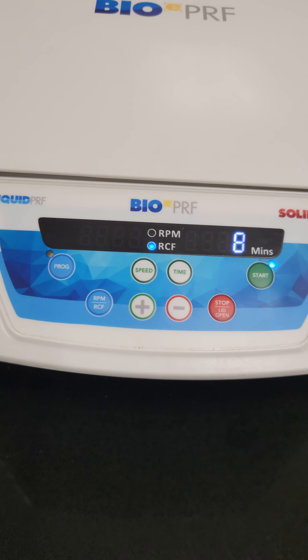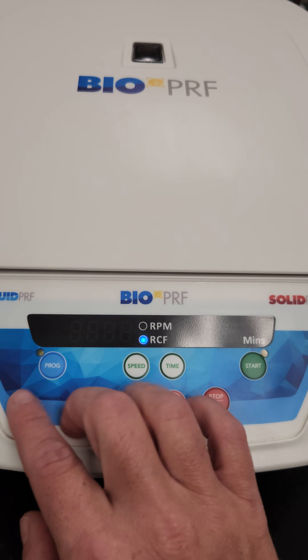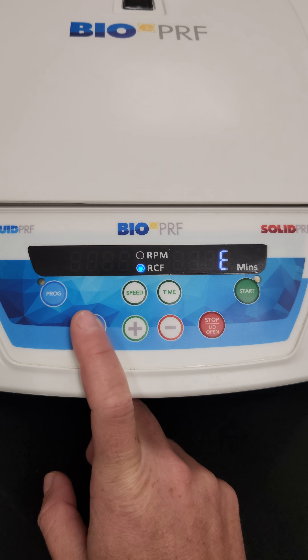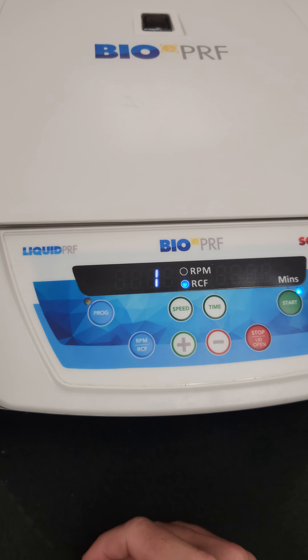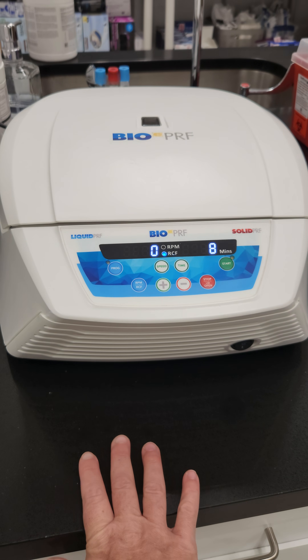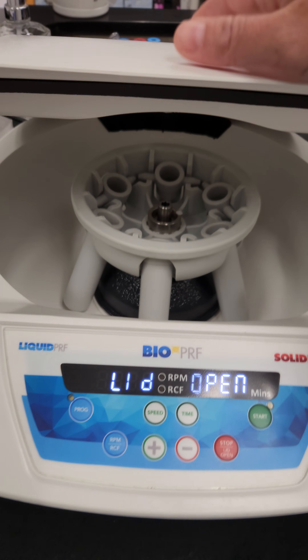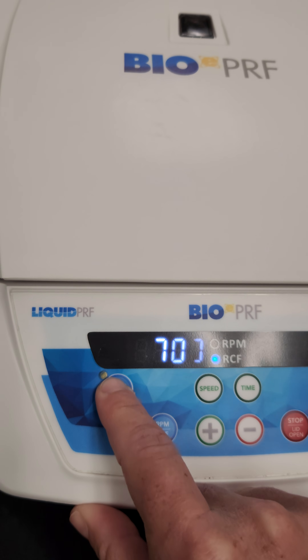Now if you would like to program your centrifuge so you can have settings already in place, you're going to go to the program button right here once the centrifuge is done spinning. Wait for it to come to a complete stop — the lid will pop back open to let you know it's done. Then to program, hit the program button here and press and hold.